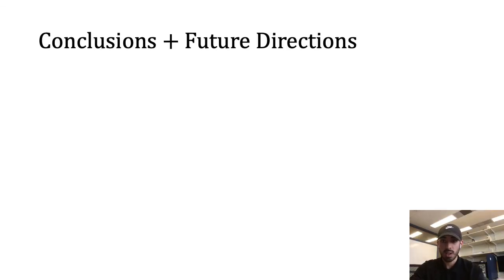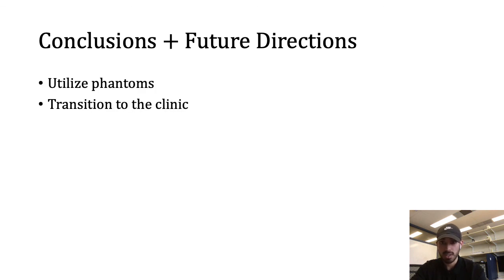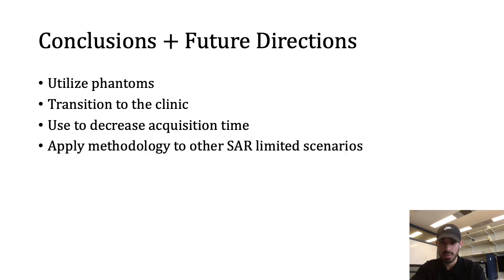In regards to conclusions and future directions, my pulses provide a more linear phase while also reducing energy and replicating the parameters that are currently used in the clinic. Now we are going to confirm what I calculated through phantoms, hopefully eventually transitioning into the clinic, which will be used to reduce the acquisition time. Also, this proves that we can probably use this methodology in other SAR-limited sequences specifically, which is very exciting.